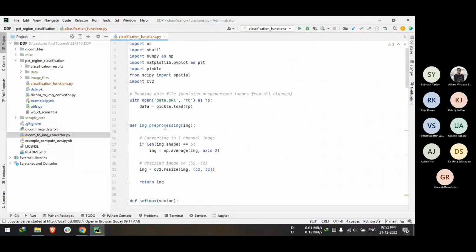Yes. So the main objective of this project, the small objective which we are working on right now, is to find where exactly the tumor has spread using a combination of PET scans and CT scans. Right now I have created a module which can segment a given CT scan by whether it is in the region of head, neck, thorax, abdomen or legs. So this is the small demo which I would like to show.